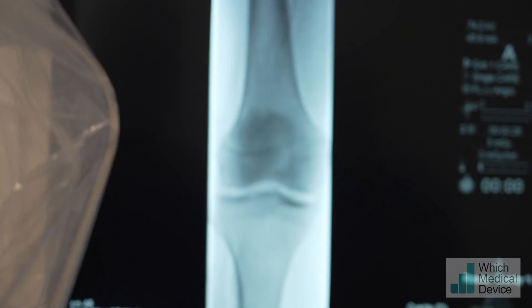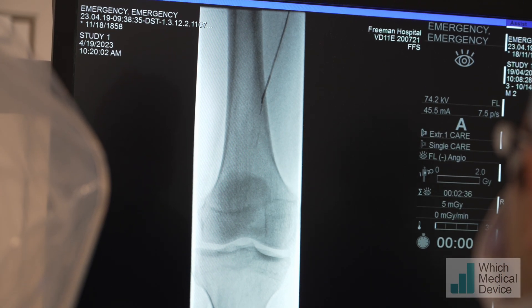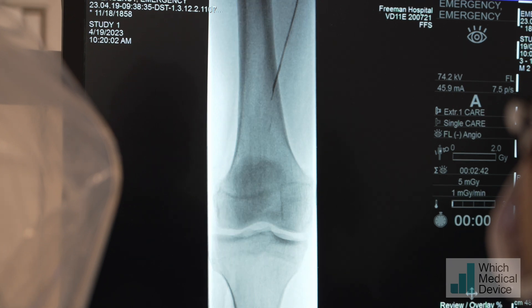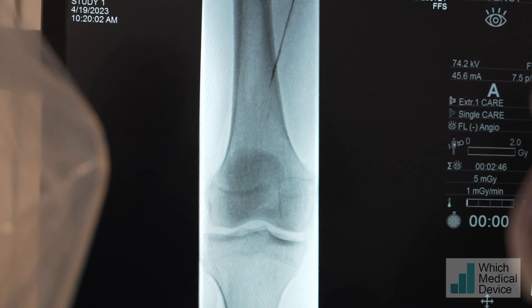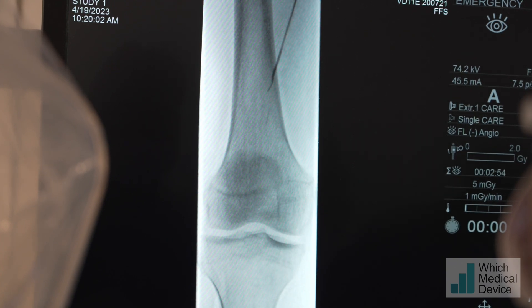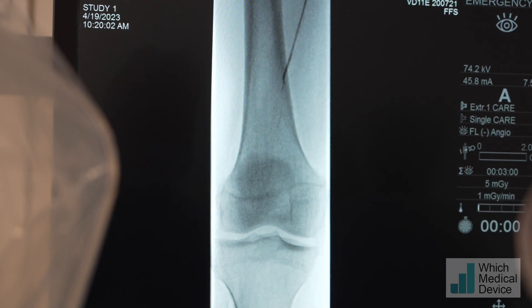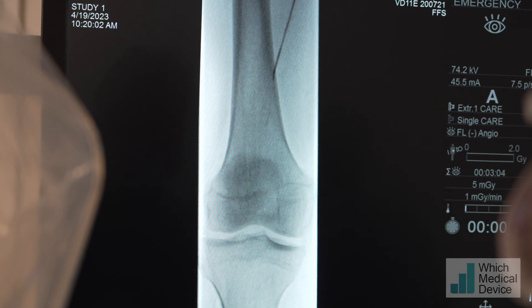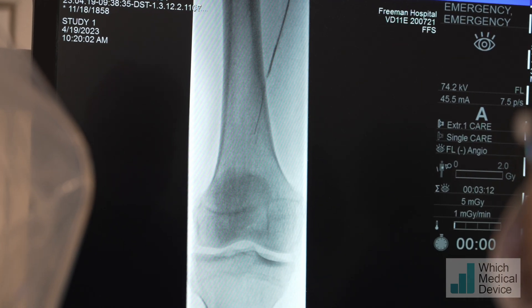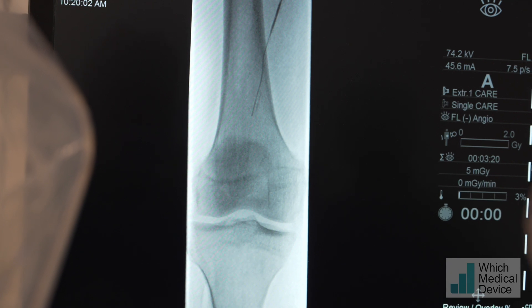It's likely not going to work but we can give it a try. So that's the Vector 2 with the straight wire - just try to redirect it a little bit and see if that crosses through that narrowing. There is definitely resistance here. If you're making progress, carry on. I'm coming a little bit further back - that feels very different now, much more easily. It feels completely different - promising.